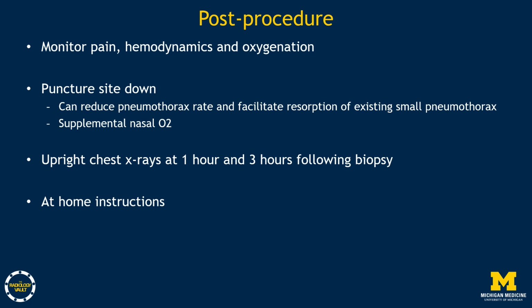Patients should be confined to their bed and kept NPO until the first chest X-ray is obtained at 1 hour following the procedure. If there is no pneumothorax or a small pneumothorax is unchanged, patients can move, eat, or drink and use the restroom. A second chest X-ray is then obtained at 3 hours post-procedure, after which the patient can be discharged if there is no pneumothorax or a small pneumothorax is stable, and if there are no other clinical concerns. Patients should be advised to temporarily avoid strenuous activity as this can trigger a delayed pneumothorax. New onset chest pain and shortness of breath should prompt an immediate visit to the ER to evaluate for pneumothorax.